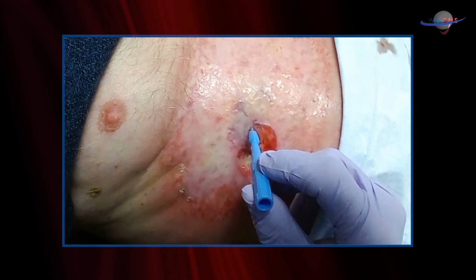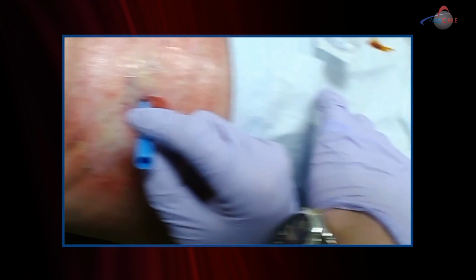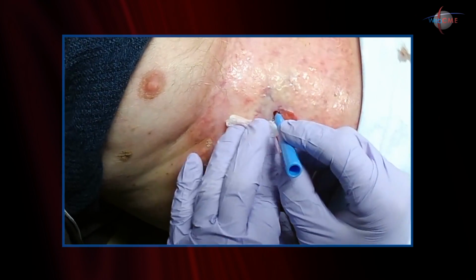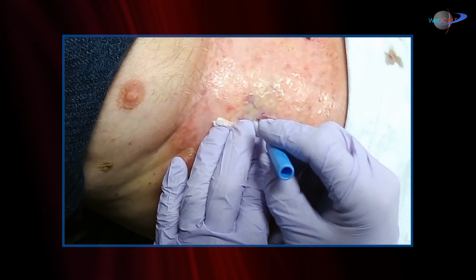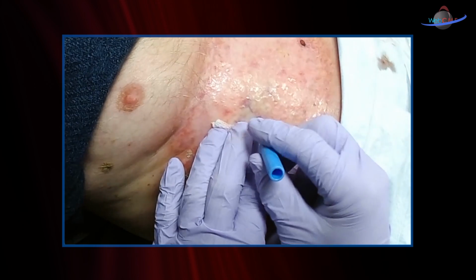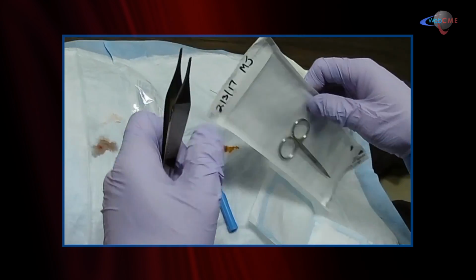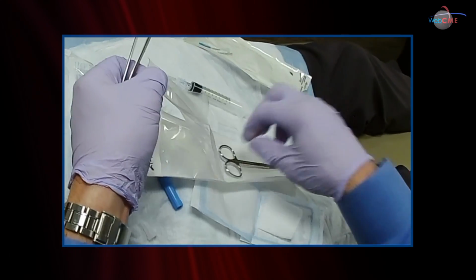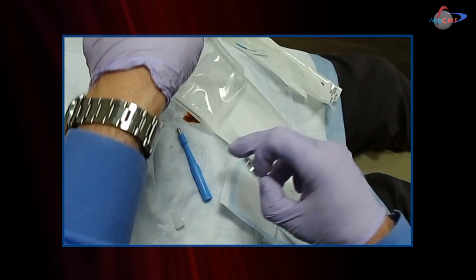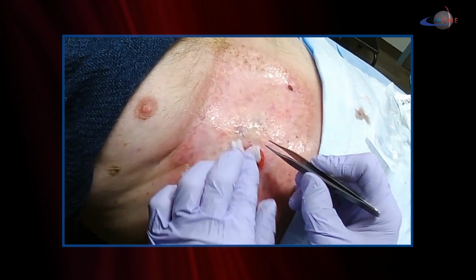We then spin the biopsy instrument. Gentle pressure. And then we release, holding pressure. We're now going to take that biopsy core. You can see there's the core of the tissue.